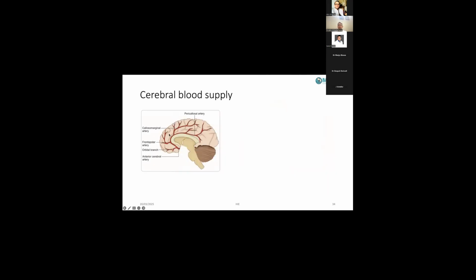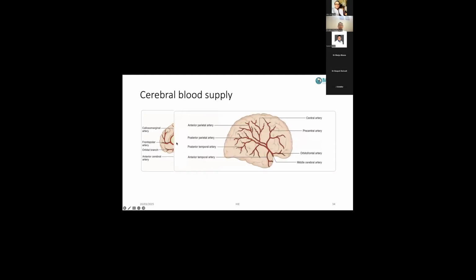So I'm interested in the anterior cerebral artery. That's a sagittal section of the brain. The best acoustic window to interrogate the anterior cerebral artery is the anterior fontanelle. Or on again a sagittal view, the outermost part, the middle cerebral artery. Any guesses which window you're going to use to interrogate the middle cerebral artery? Temporal, yes, temporal is correct. And mastoid, yes. So you can see it is running through the temporal lobe.